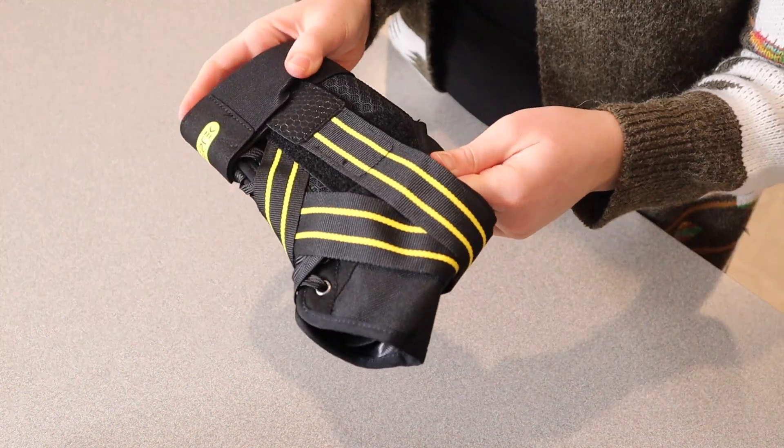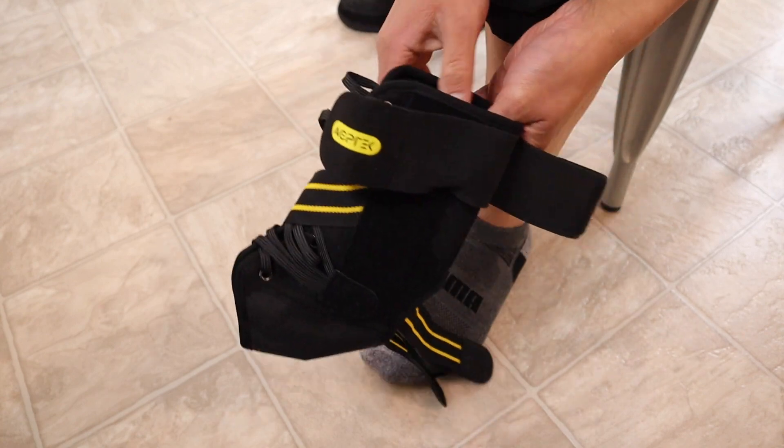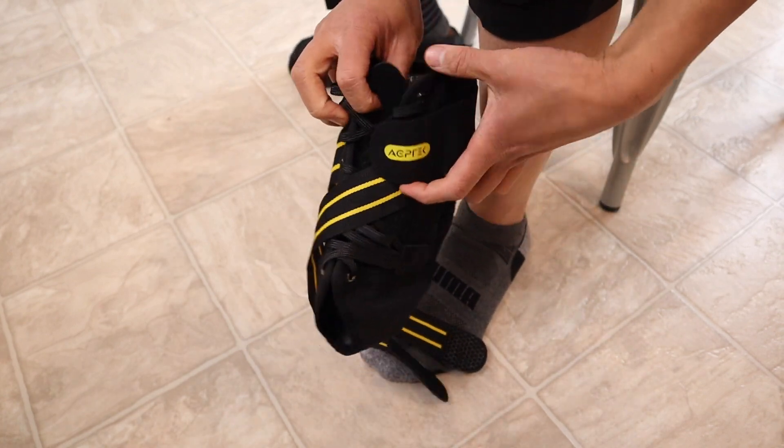I'm going to go ahead and grab my husband so I can show you how to put this on. The first step is to loosen all the ankle straps so that we can put the foot in here nicely.